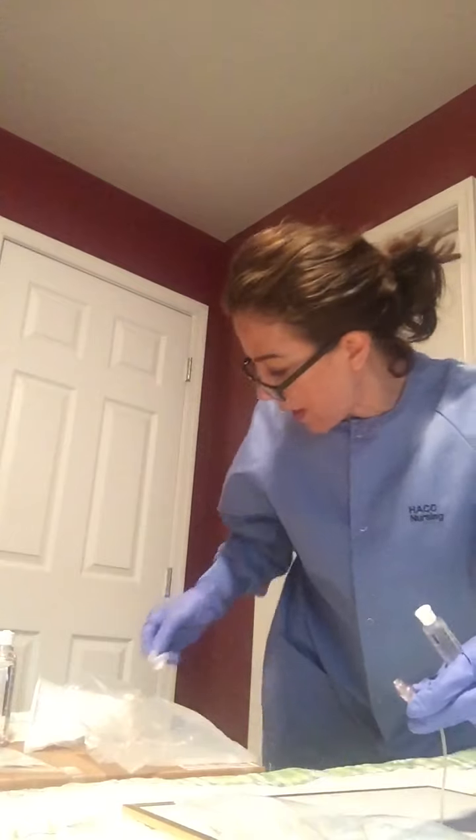I'm going to clean this port here for 15 seconds. Real thorough. And then I let it dry for 15 seconds. And then I would put that over here.